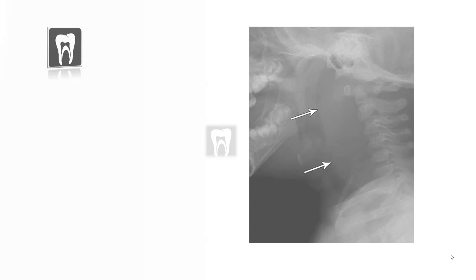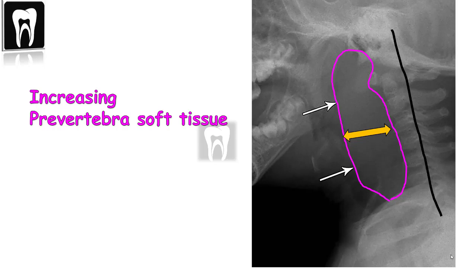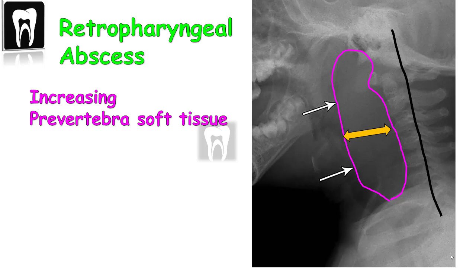In this case, we see an increase in the prevertebral soft tissue in a patient with difficulty breathing and fever. There is also loss of the cervical lordosis — the cervical spine is straight. This is diagnosed as a retropharyngeal abscess, and this is also an airway emergency.